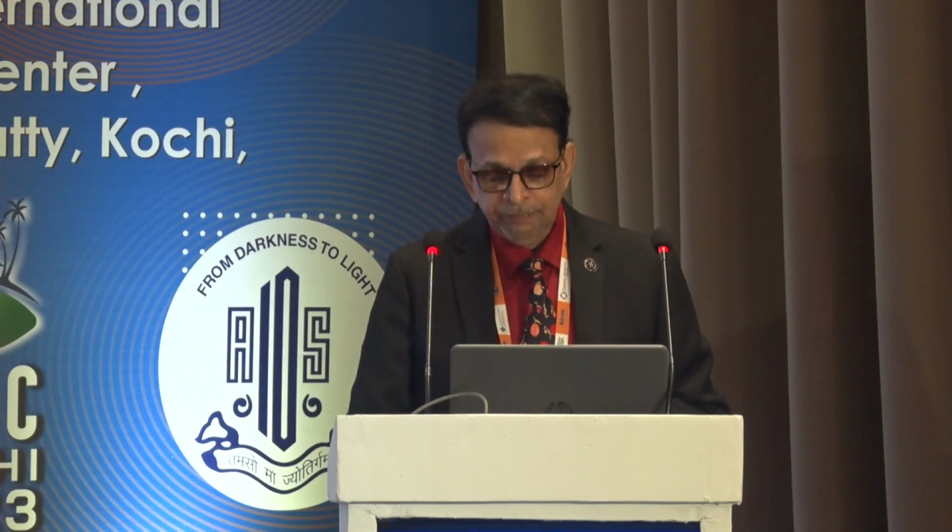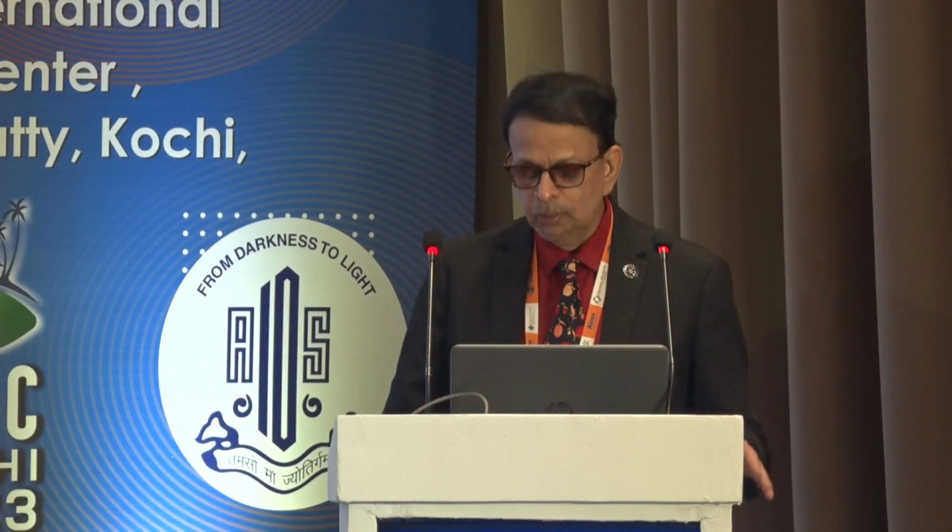Now and then put Viscoat into the anterior chamber. I don't have any financial interest, but Viscoat works very well, because it prevents corneal endothelial damage. You can have clear corneas. You can see how the entire surgery goes on, and you are making sure that you are right there, not near the rhexis margin, because I don't want the iris to come into the port. So you reduce your parameters. Normally, if you are using about 500, use about 300, and if you are using a peristaltic machine with an aspiration flow rate of about 50 or 60, you reduce it to about 25 or 30, because you don't want non-target tissues like the iris and the posterior capsule to come forward as well.